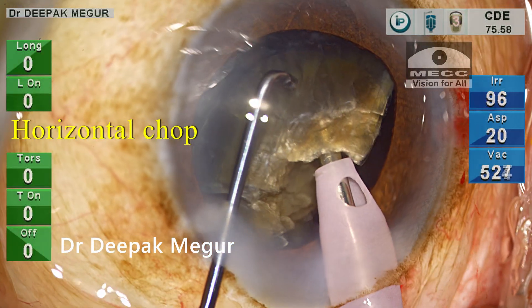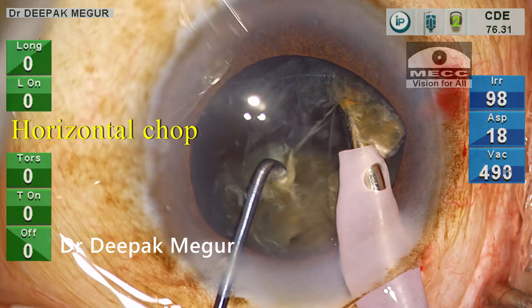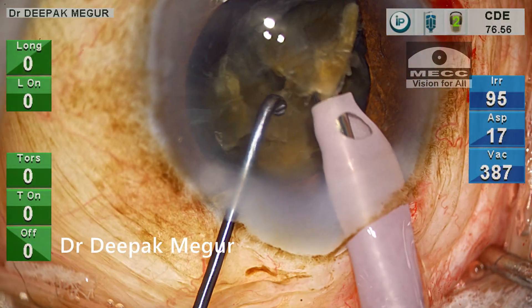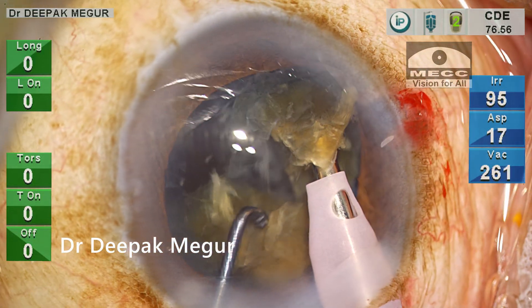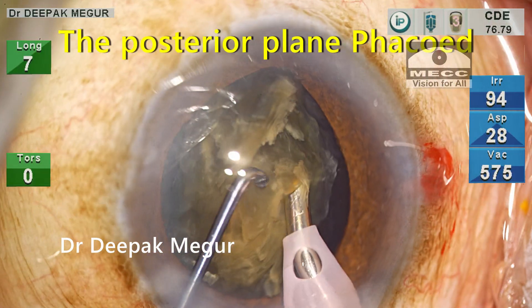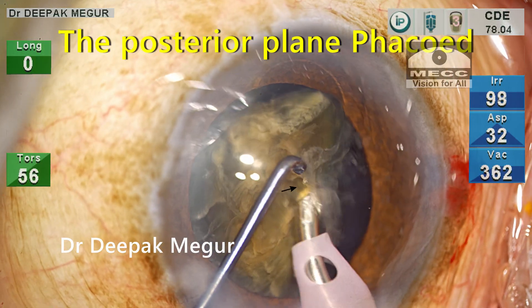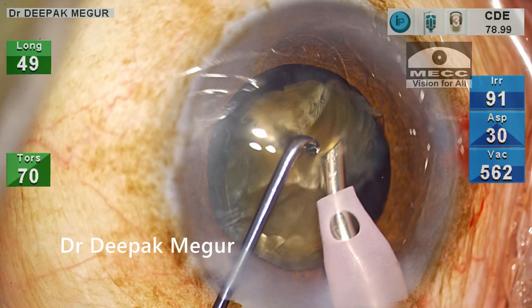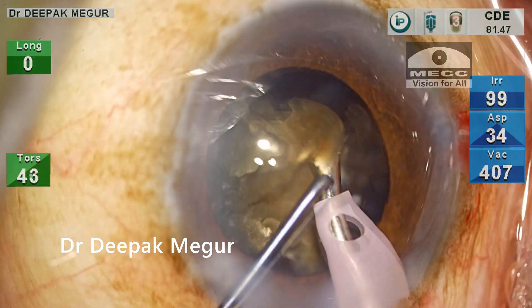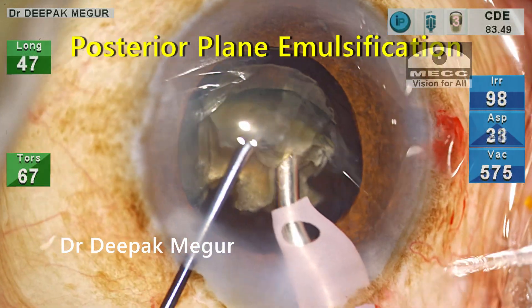I'm now performing a horizontal chop using a blunt chopper. The posterior plate separation is difficult, so instead of struggling with lateral separation I go ahead and phaco with that part of the attached posterior plate. Since the bag is relatively empty, we have access to the posterior plate; by manipulating it anteriorly, the attached areas are emulsified, freeing up the fragments. These fragments are then consumed in a very controlled manner, with the majority of the nuclear fragment still behind the iris during emulsification, confirming the posterior plane of emulsification.